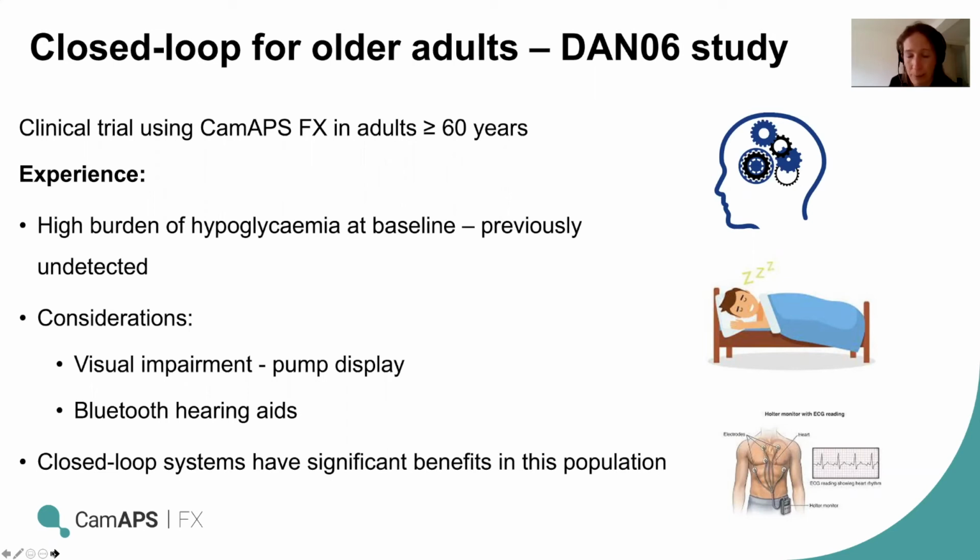but it was nothing that we weren't able to get round with support and assistance. And we also had a couple of people who were using Bluetooth hearing aids that we hadn't thought about beforehand. And we were slightly concerned that these might interfere because all the devices communicate via Bluetooth, but actually this was completely fine and we didn't run into any issues with it. So just a heads up for any Bluetooth hearing aid wearers.